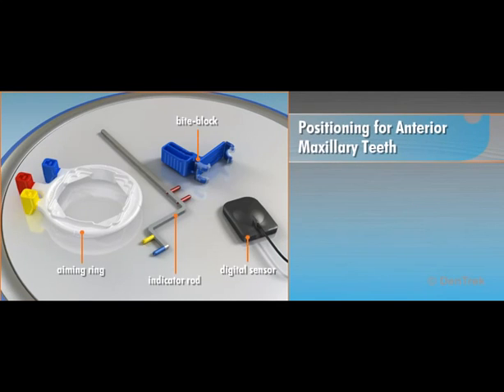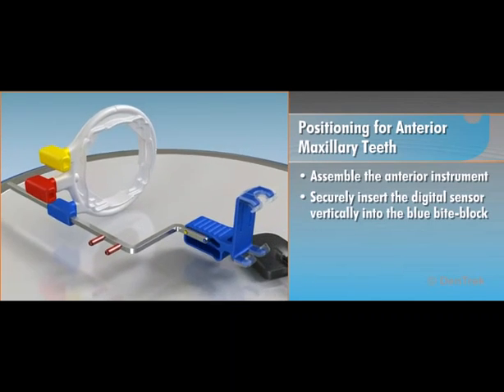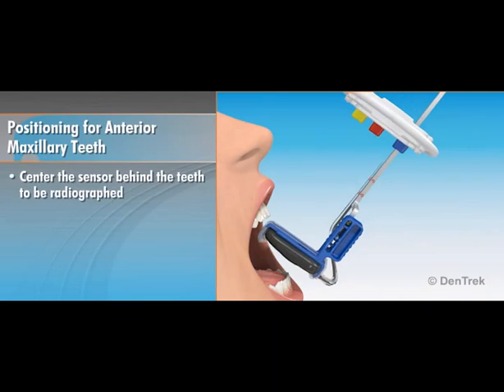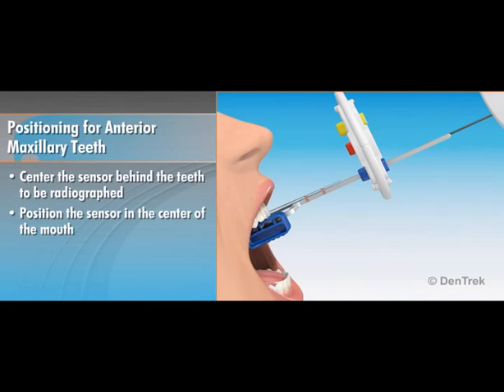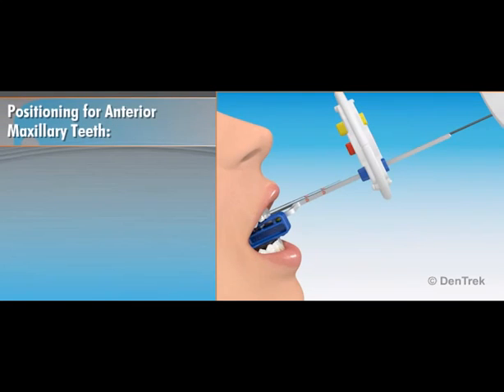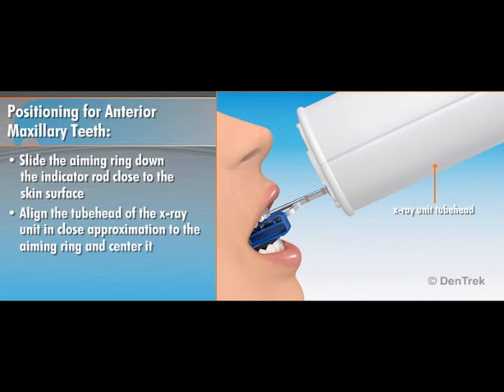To position the XCP-DS-FIT digital positioning system for anterior maxillary teeth, assemble the anterior instrument and securely insert the digital sensor vertically into the blue bite block. The active area of the sensor should be placed against the flat surface of the backing plate. The XCP-DS-FIT is a universal sensor holding system with a self-adjusting retention clip that stretches to fit both size 1 and 2 sensors. Center the sensor behind the teeth to be radiographed and position it in the center of the mouth. With the bite block placed on the incisal edges of the teeth, instruct the patient to close slowly and bite gently to retain the position of the sensor. Once the bite block is in place, slide the aiming ring down the indicator rod close to the skin surface, then align the tube head of the X-ray unit in close approximation to the aiming ring and center it. You are now ready to take the X-ray exposure.